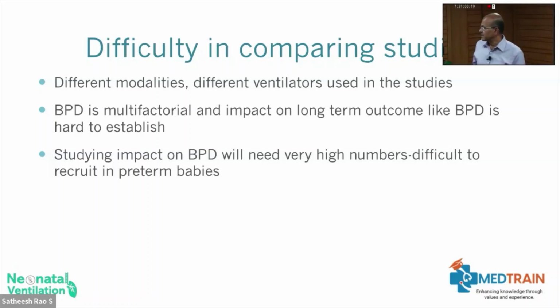And BPD is multifactorial, and the impact on long-term outcome like BPD is hard to establish. So I told you about synchronization, it doesn't show a benefit on BPD, but that doesn't mean it's not effective. It just means that the study cannot show that because of the multifactorial nature.